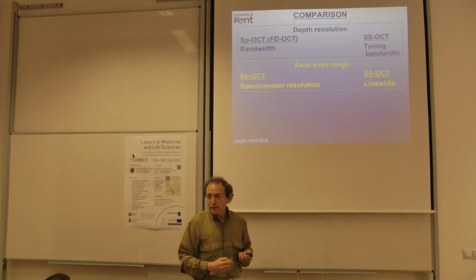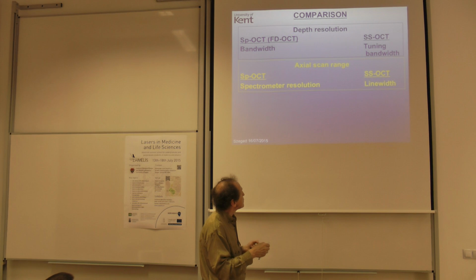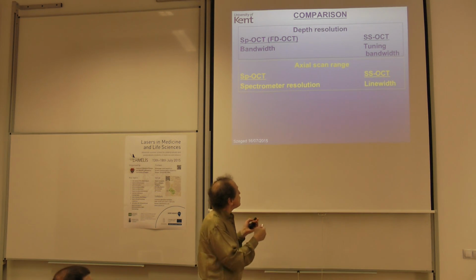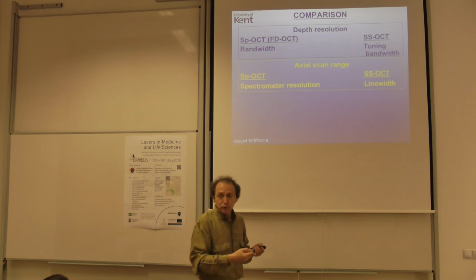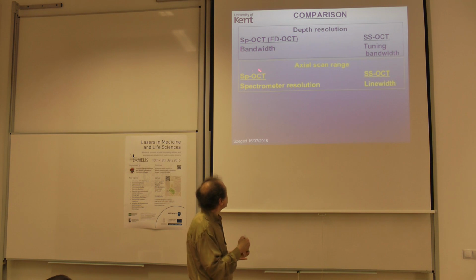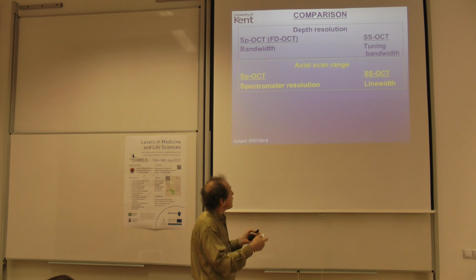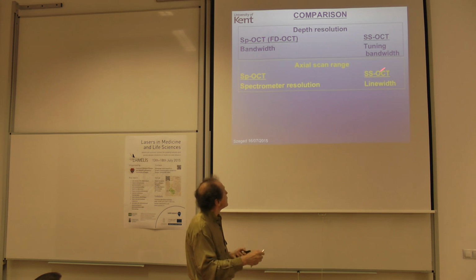Now, there is another limitation. When I explained the way time domain works, I told you that that sketch explains both time domain and spectral domain in terms of the range, because it's this idea of phase relation between the waves. What you need for interference is waves which carry the same relation between the object and the reference. And if you delay too much, you lose that phase relation. So practically the axial scan range is limited by the coherence length of your optical source in the tunable laser, and you can make an association with the coherence length of the wave coming from the spectrometer. It's the spectrometer now which diffracts the waves, and that creates an equivalent. Practically by diffraction we increase the coherence length, the physicists will know, but it's the same limitation. It's the coherence length of the waves interfering in both spectral domain technologies.